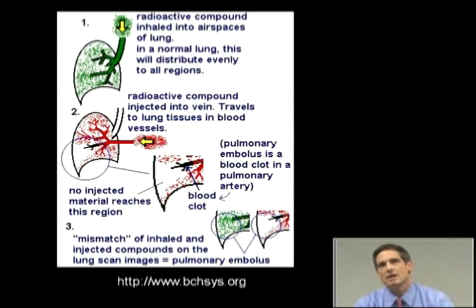Just to remind you, this slide will show you the steps in sequence for doing a nuclear medicine pulmonary ventilation perfusion study. You need to take radioactively labeled particles and put them into the patient's bloodstream. Those will then filter out in the lung pulmonary parenchyma, and any area that doesn't get blood flow because it's downstream from a pulmonary embolism will show up as a cold spot, whereas all the rest of the lungs will show up as warm spots, or the whole lungs will be warm.